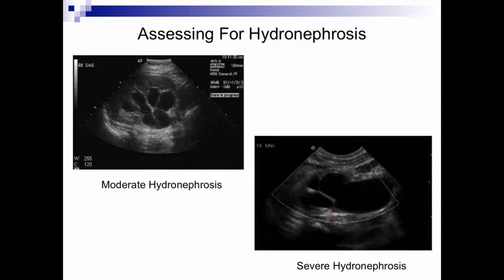So in the setting of a patient who is perhaps having septic shock secondary to a urinary source, if you haven't already imaged them with a CT, or if they're too unstable to go to a CT, you should be doing this. And obviously if they have obstructive uropathy, decompress that side of the urinary tree.